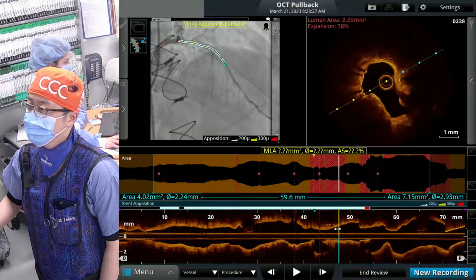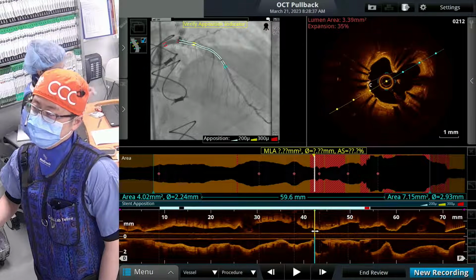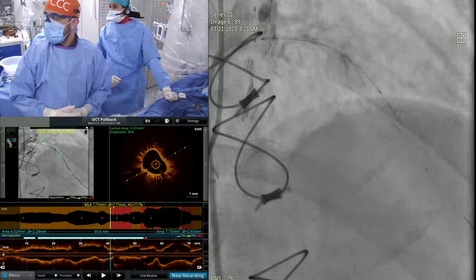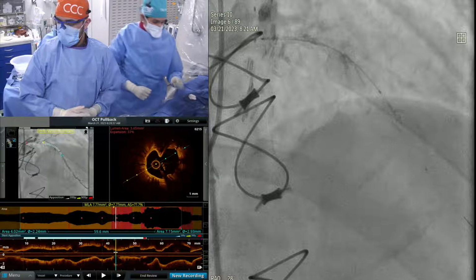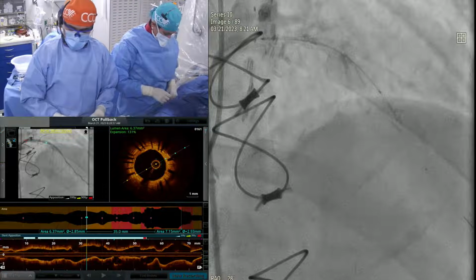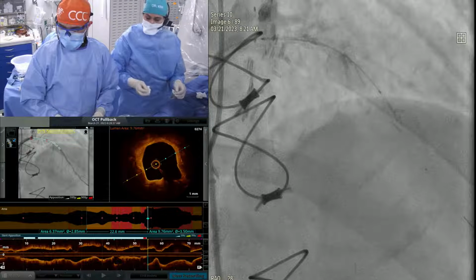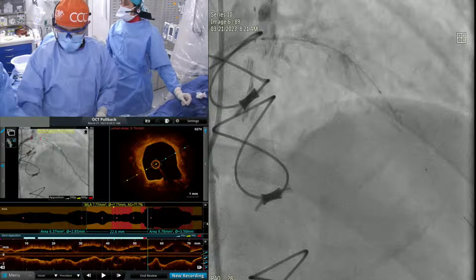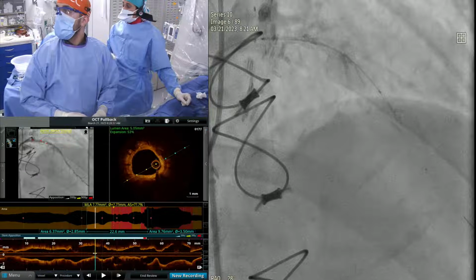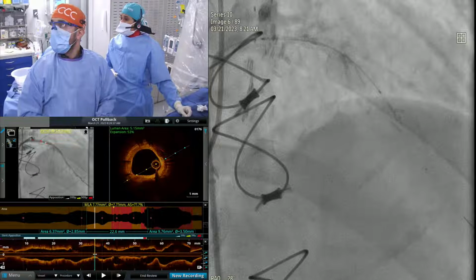Because of the calcium behind the stent struts and the proximal, we are going to do a rotablation and then decide to add IVL or just go to high pressure or a cutting balloon. I think this is the case. You need to crush the diagonal arm? Doesn't need to now because there is a good graft from the diagonal to LPL. One layer or two layers there? To me, it looks like one layer.